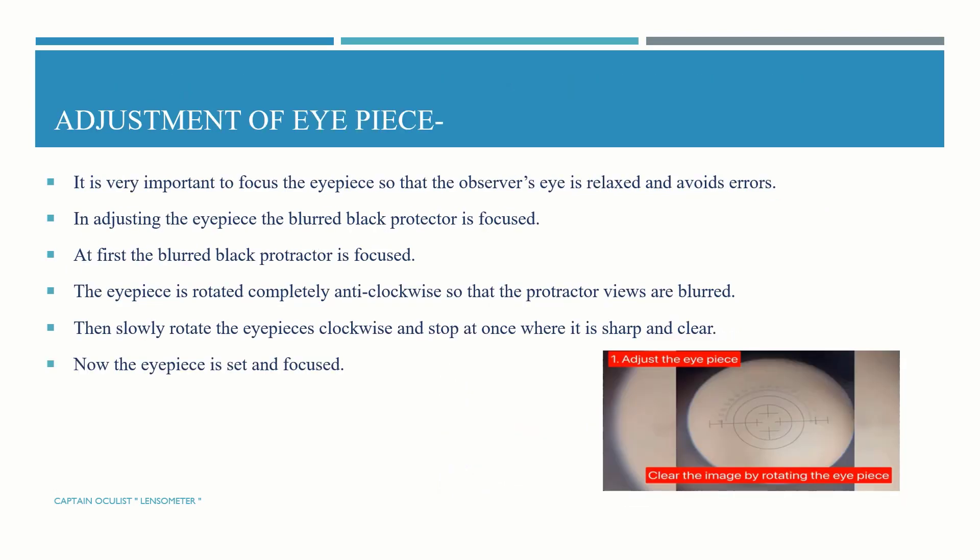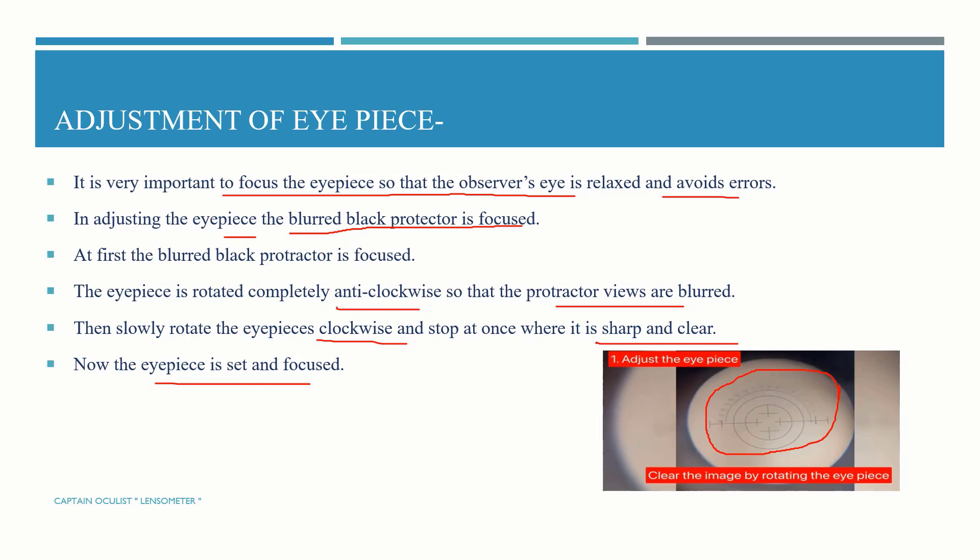Adjustment of the eyepiece: it is very important to focus the eyepiece so that the observer's eye is relaxed and errors are avoided. When adjusting the eyepiece, the blurry black protractor is focused. Rotate the eyepiece completely anti-clockwise so that the protractor becomes blurry, then slowly rotate the eyepiece clockwise and stop at once where it is sharp and clear. Now the eyepiece is set and focused.